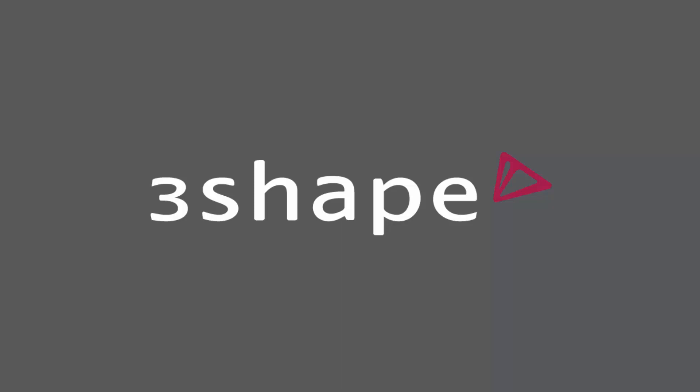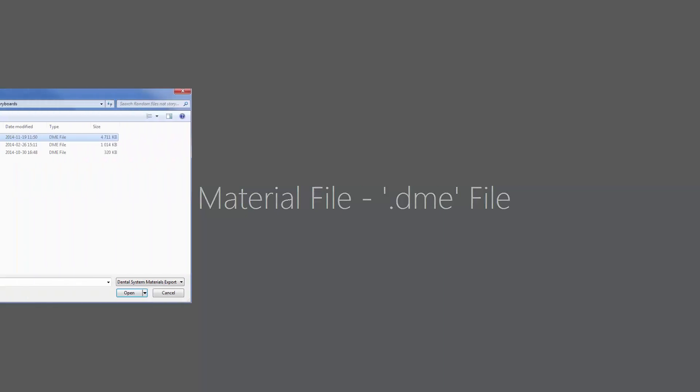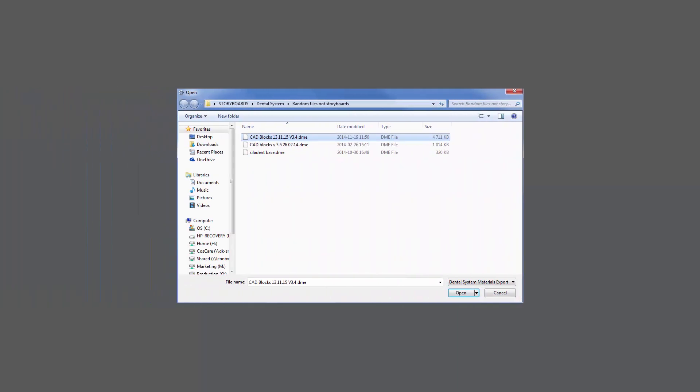In this video we will show you how to import material files into the dental system. Material files are also known as DME files.